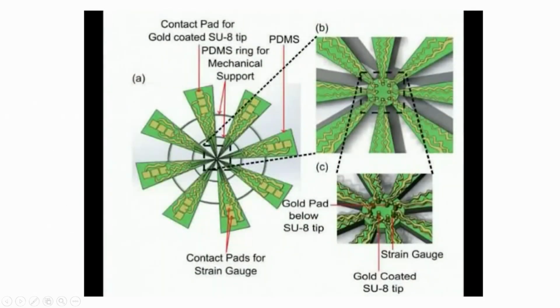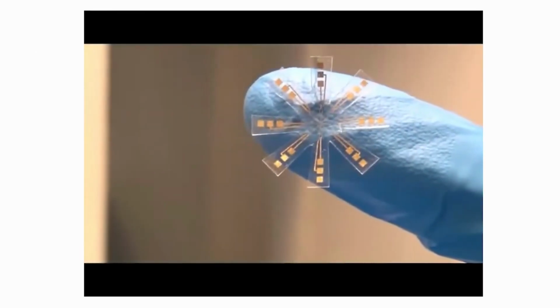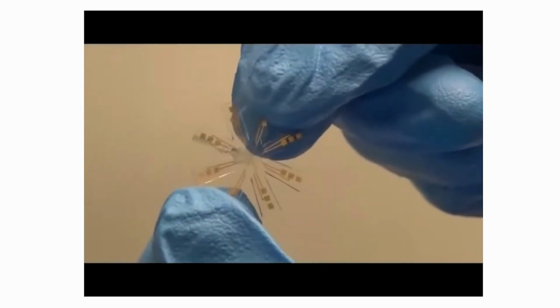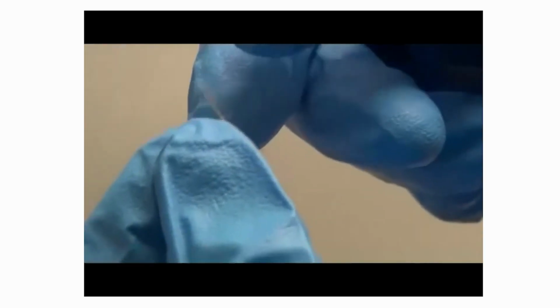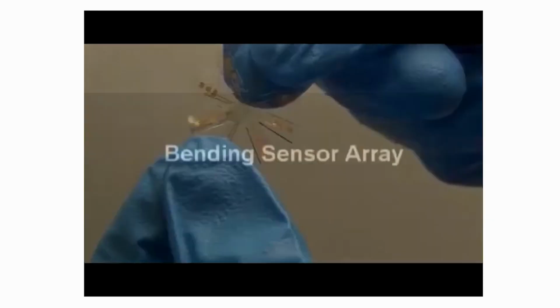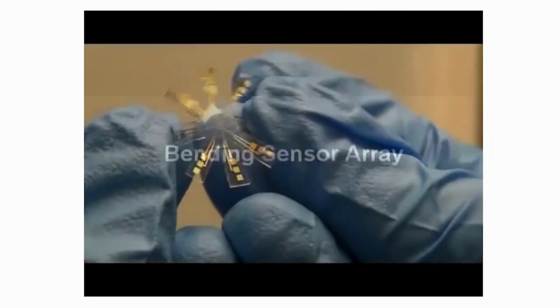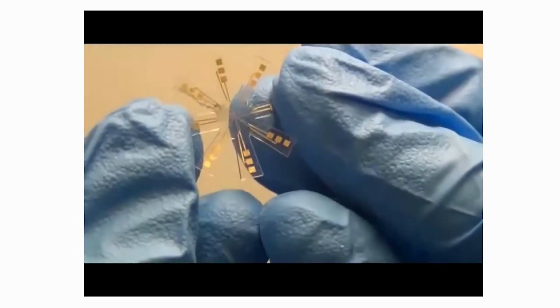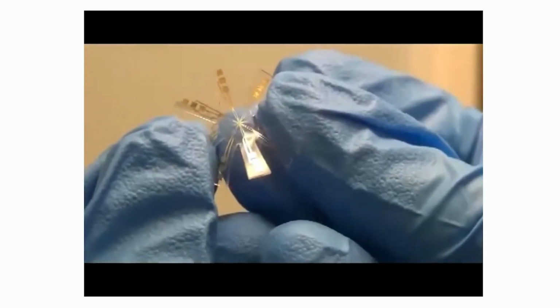We have just seen the schematic of the sensor, and now the sensor, or the MEMS based device that is detached from the substrate, is stretched to evaluate the performance, to check that we get the same base value of the piezoresistor and to see whether it will break or not. We have also tested bending, by bending the MEMS device we have tested its property.